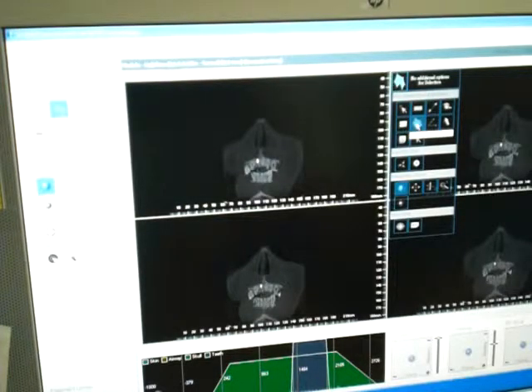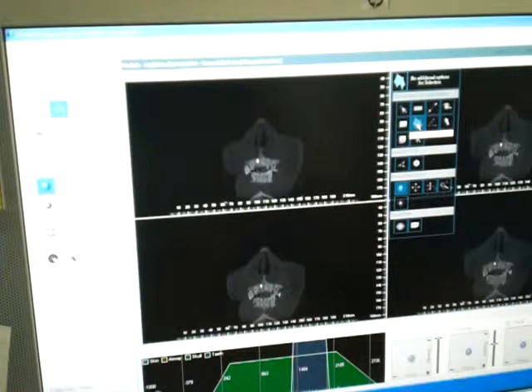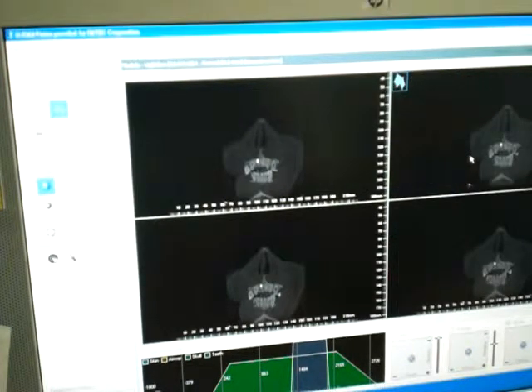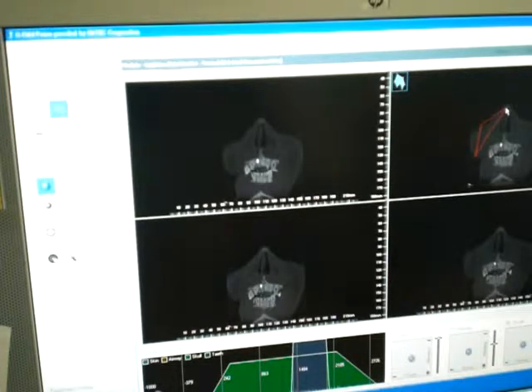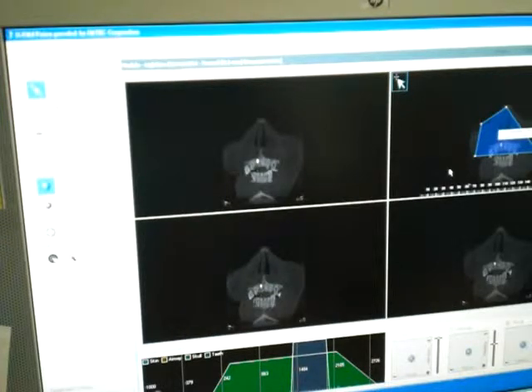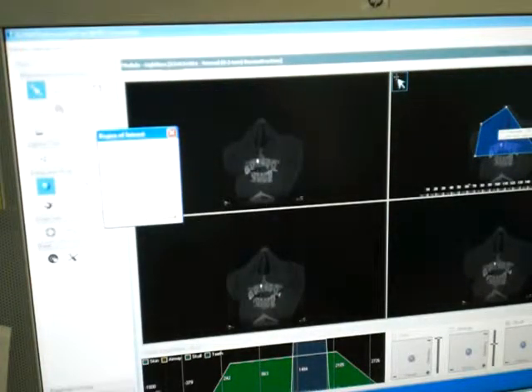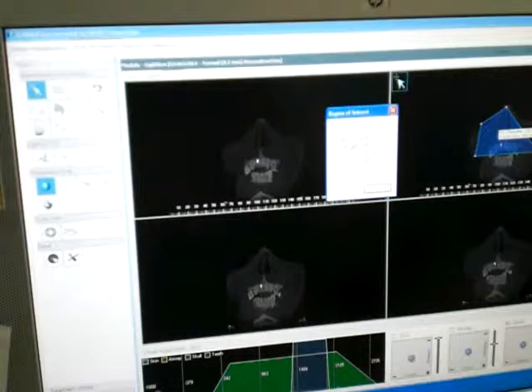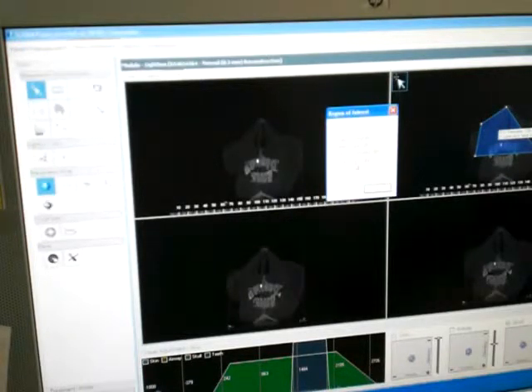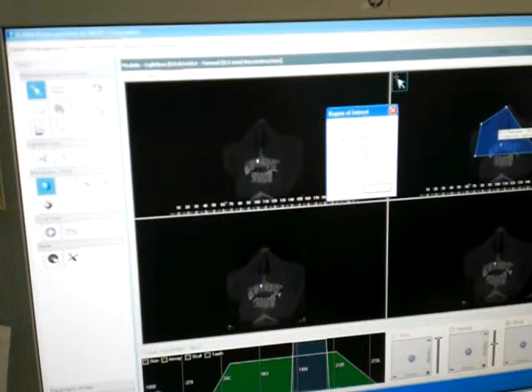This next tool is 'Create a Region of Interest.' It's similar to the profile, but instead of a line you draw a region — like a circle. Click on it, draw the region, then double-click to finish. It gives you statistics for that region: minimum, maximum, average, and standard deviation values.